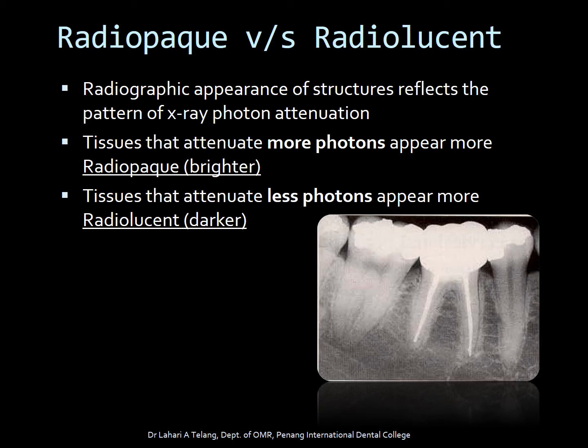First of all, it is important to understand the difference between what is radiopaque and what is radiolucent. The radiographic appearances of structures reflect the pattern of X-ray photon attenuation. Tissues that attenuate more photons appear more radiopaque or brighter, and tissues that attenuate less photons appear more radiolucent or darker. Based on the radiograph here, the radiolucent aspect is the pulp, and the radiopaque ones are enamel, dentine, or restorations.